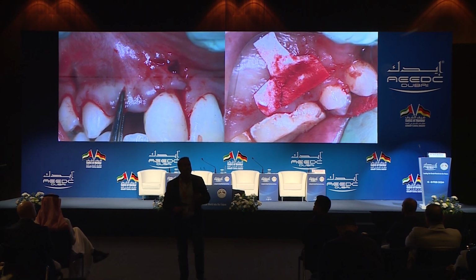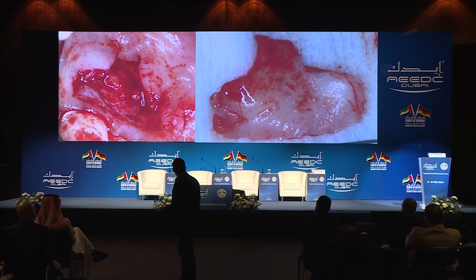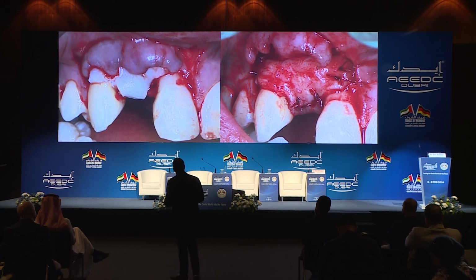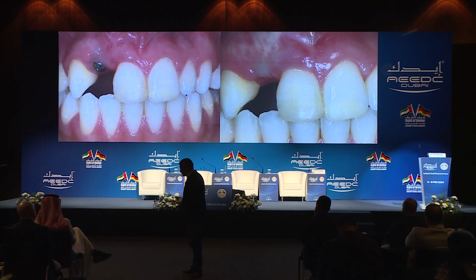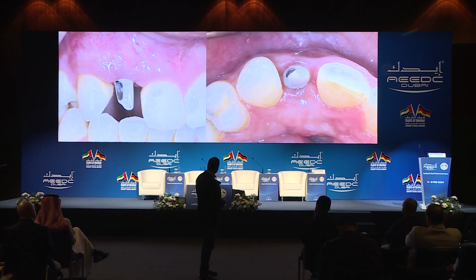So we always do our connective tissue graft customized, trying to build the connective tissue vertically and horizontally. And this is the connective tissue graft placed in a position where we suture it and put the implant to sleep. And then we wait 3 months for the maturation of the soft tissue. And after 3 months, we just connected the abutment.